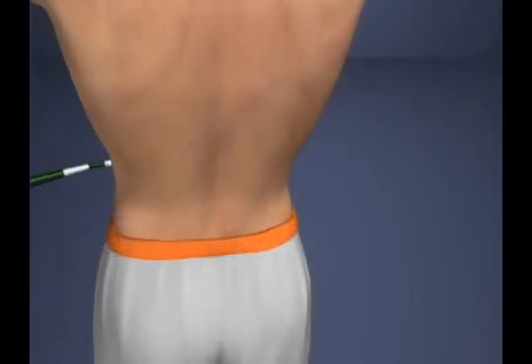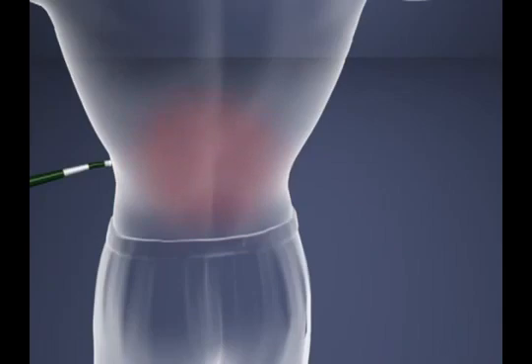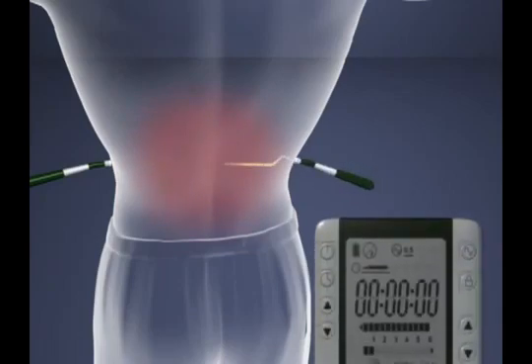Connect the 2 sides. Place one probe below the treatment area and the other in the same place on the opposite side. Repeat in a few places.